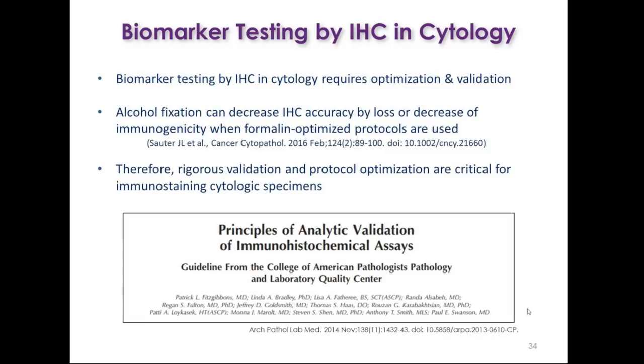So the CAP actually has guidelines in terms of how to validate for IHC assays. This is currently being updated, so there will be an updated guideline for IHC validation, and it's important to make sure that your IHC assays are validated, especially because when you're reporting predictive and prognostic markers, these impact how the patient's going to be treated. So this is critical that we validate our assays.